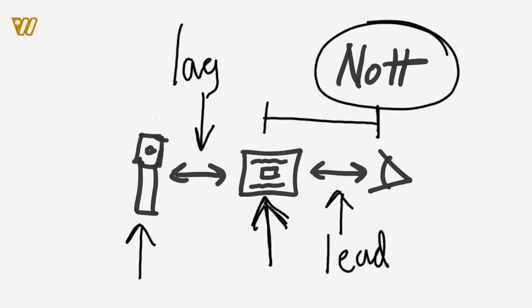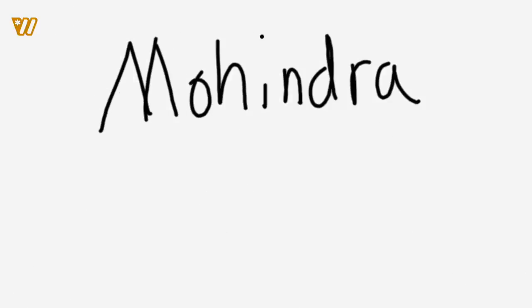All right, let's continue on and talk about Mohindra retinoscopy. So Mohindra retinoscopy is also a near retinoscopy measurement. There's a couple of key points that I want you guys to know about it. Mohindra retinoscopy has some historical context. It's not something that we use a lot now because what it's trying to do is measure latent hyperopia. So it's trying to help you measure the refractive status in children and infants.